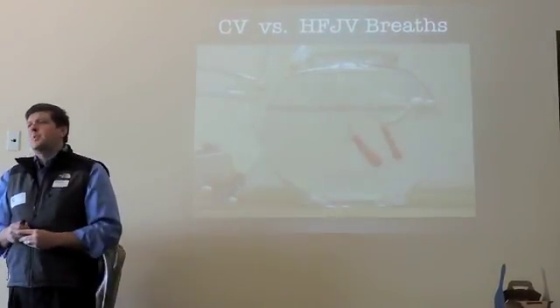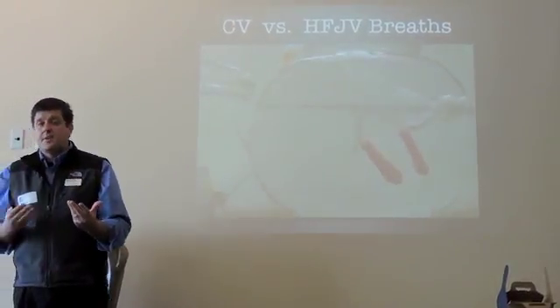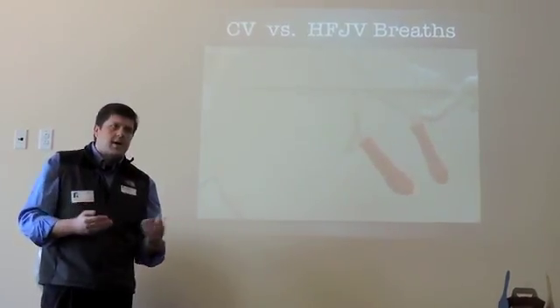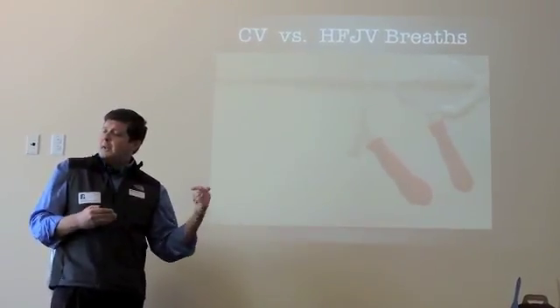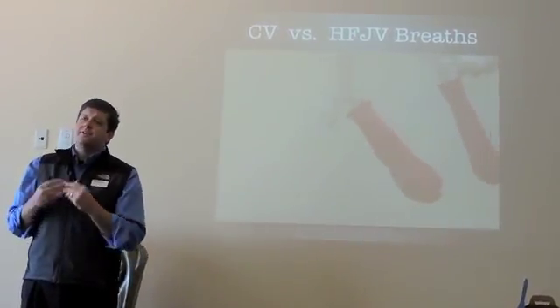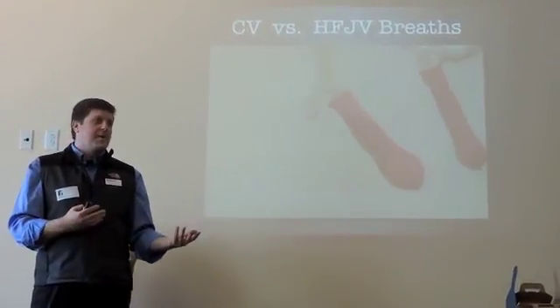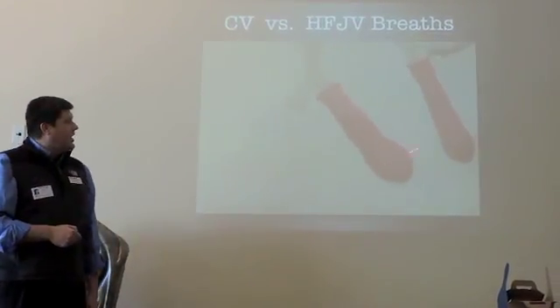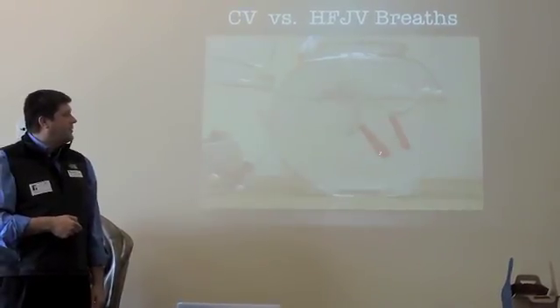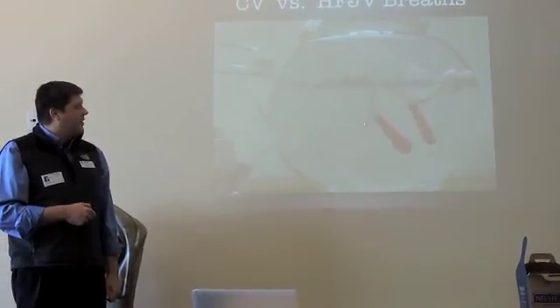But it is important to recognize the differences between the two ventilators and the volumes that they give, of course. The conventional ventilator gives large volume. So here in a fishbowl, I've torn one of the balloons off the test lung and created an air leak. And of course, where does all this large volume go from the conventional? Right out the hole there, and you see all the bubbling. But you can see here how the jet ventilator is still ventilating the other parts, even this part right here that's directly adjacent to my injured area, my air leak.